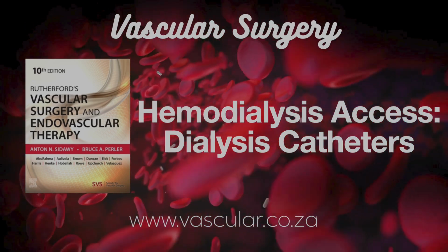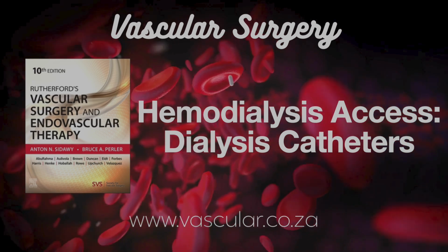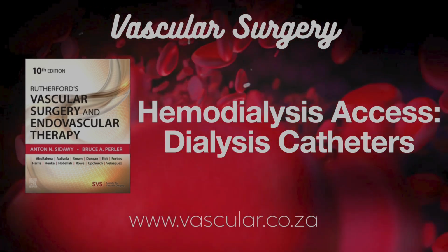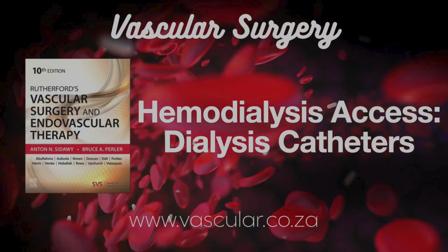Okay, the big one. Infections. Catheter-related infections. Huge concern. We break them down. Exit site infections, just redness around the skin opening, tunnel infections, inflammation along the subcutaneous path, and bacteremia, bloodstream infection linked to the catheter.